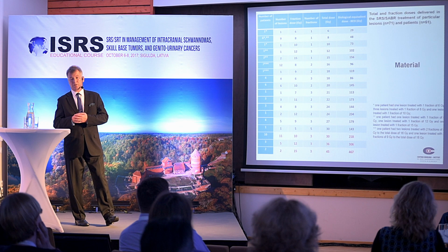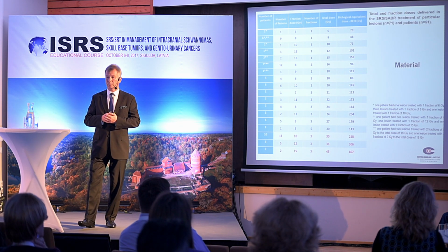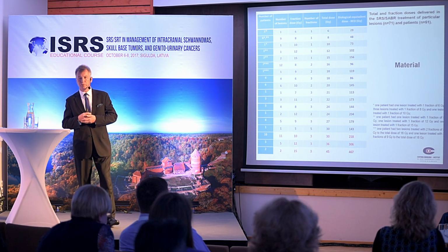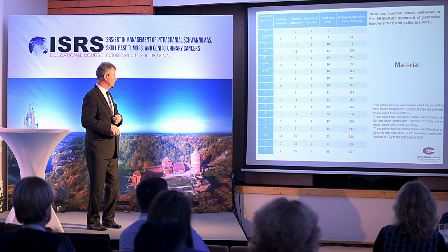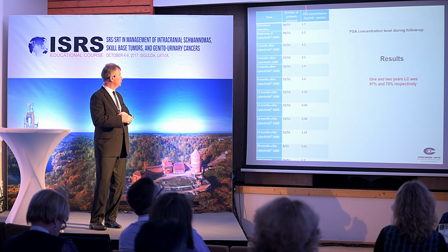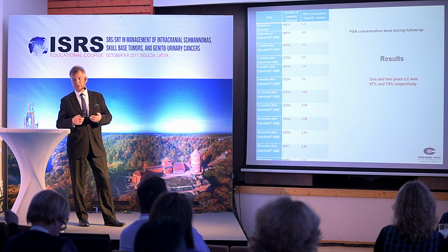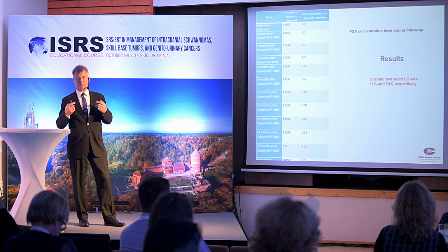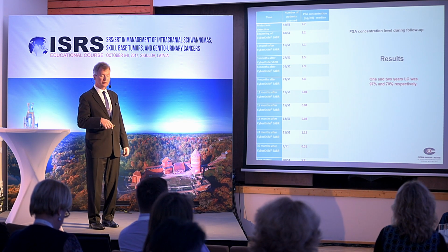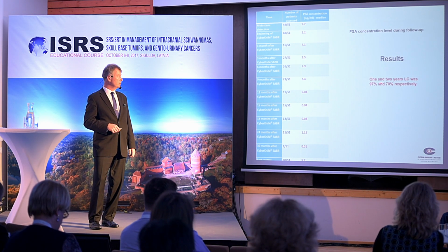As you see, we also used a wide selection of fractionation schedules, but only the last 3 ones, from the actual point of view, could be considered as radical. Toxicity, nothing about toxicity, it's still PSA decrease, so quite fast and quite large. Of course, we should be conscious that some ADT was used also in this group, as you saw previously. The local control, very good.